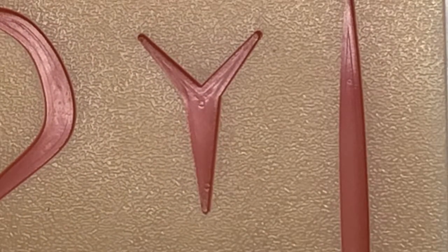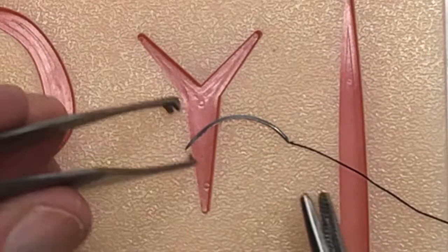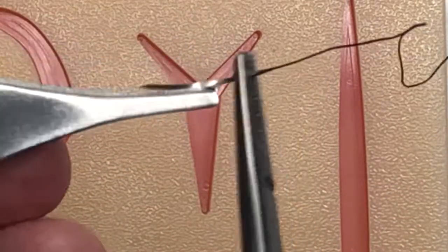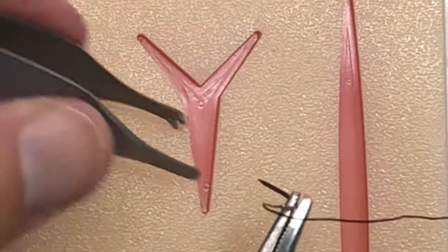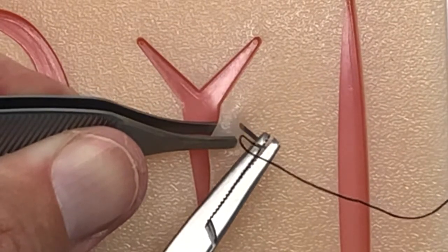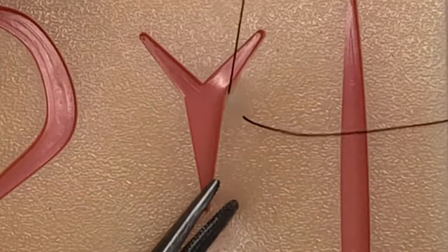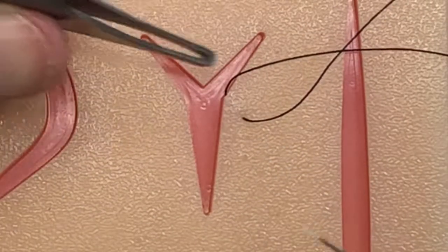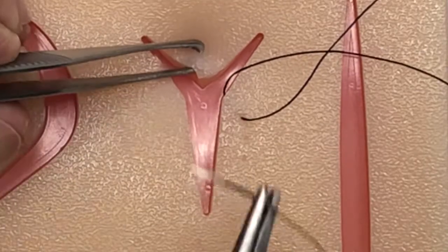So with this, we're going to take our suture material here, again, using good practice habits from the beginning. Try to manipulate the needle with your tissue forceps only, not to touch it with your fingers so that you avoid any accidental needle strikes, or needle sticks. So what I'm going to do here is use my tissue forceps to get a good handle on the tissue, come through, and I'm going to go ahead and grab the needle. And then I'm going to reload it onto my needle driver. And this is where I want to be able to utilize my tissue forceps, so that I can visualize this tissue here, and see where I really want to go to be able to get the best repair.